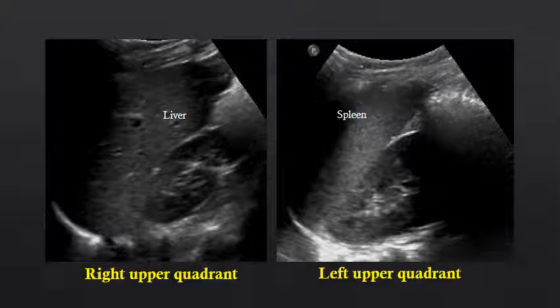That same relative echogenicity also holds true for the spleen relative to the left kidney. Notice in both of these images, the liver is brighter than the right kidney in the right upper quadrant, and the spleen is brighter than the left kidney in the left upper quadrant.